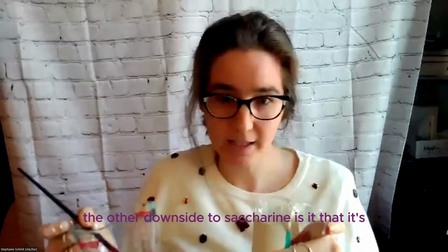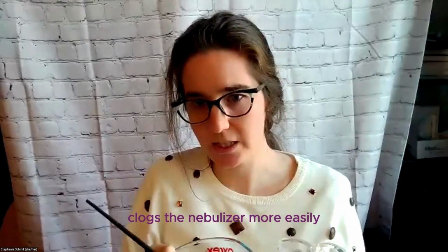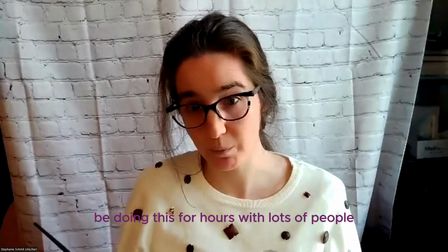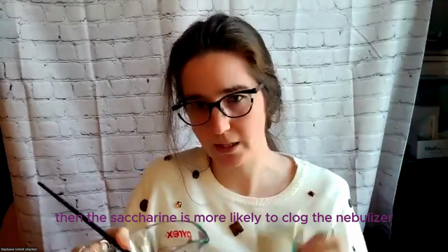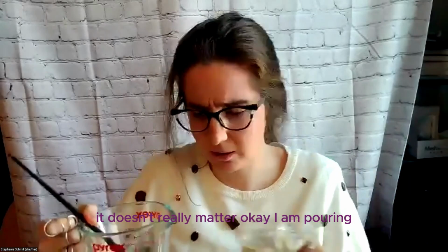The other downside to saccharine is that it clogs the nebulizer more easily. So if you're doing an event where you are going to be doing this for hours with lots of people, then the saccharine is more likely to clog the nebulizer. But if you're just one person at home, it doesn't really matter.